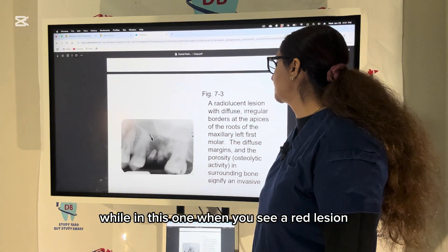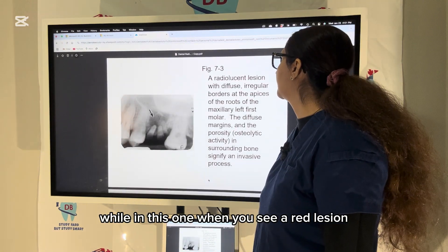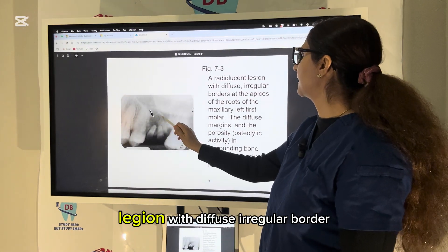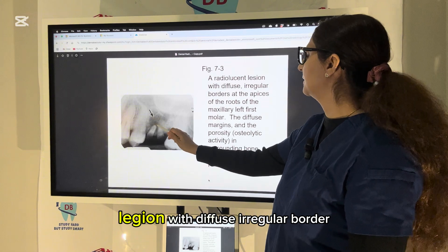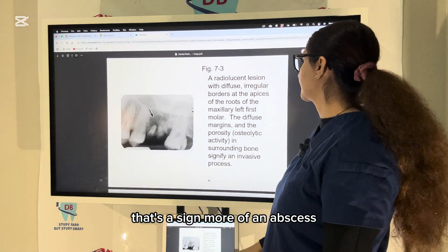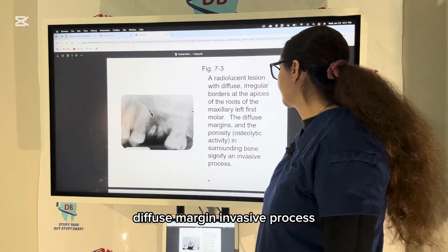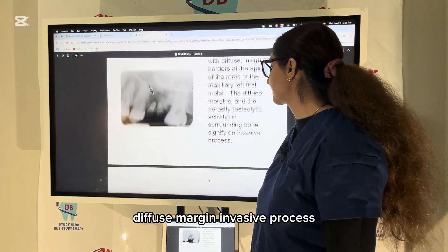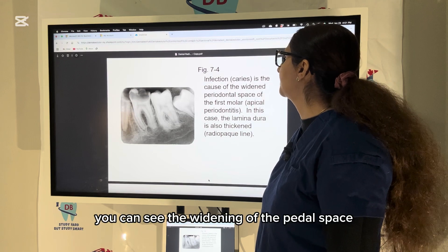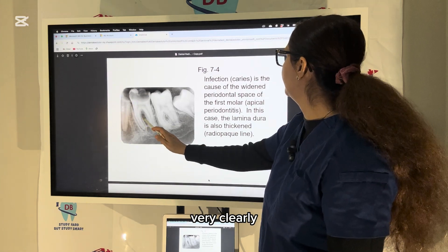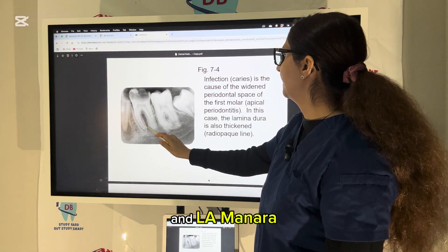When you see a radiolucent lesion with a diffuse, irregular border, that is a sign more of an abscess — a diffuse margin, invasive process.